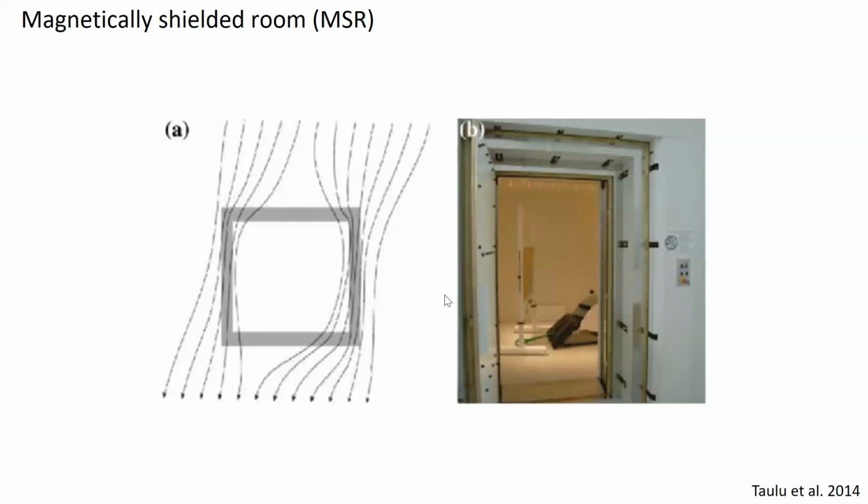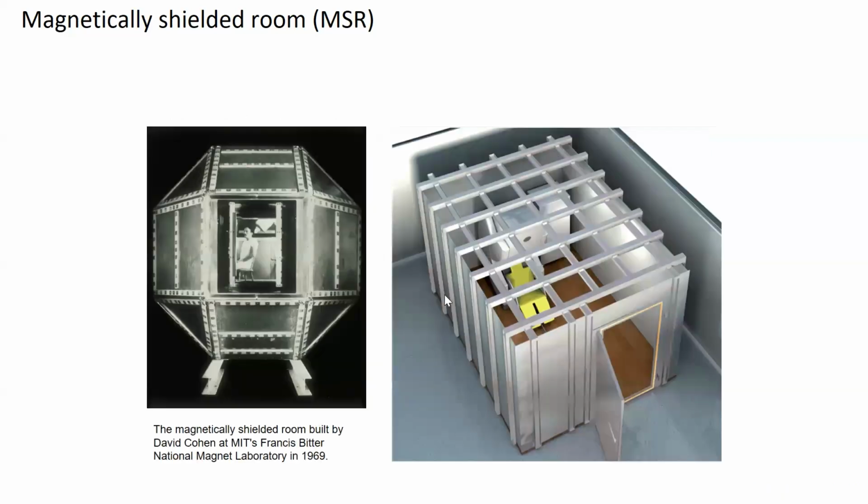I think an interesting question is going to be to see, if we decrease the size of the shields for OPM recordings with a tubular shield or with person-size shields, how these gradients, which are large close to the walls, are they still going to affect the measurements? I think that's still something that I look forward to other people presenting.